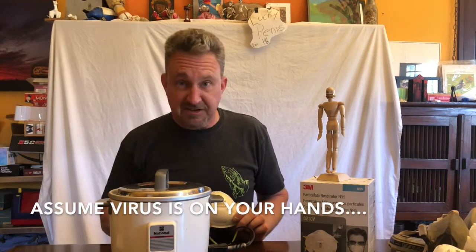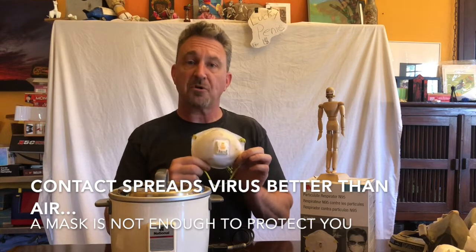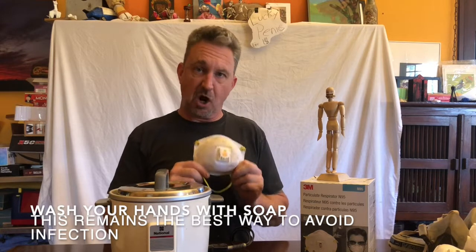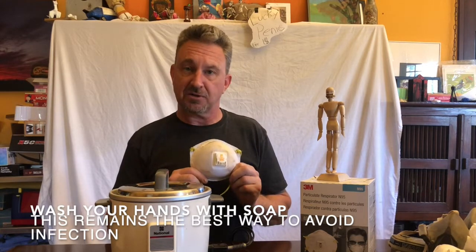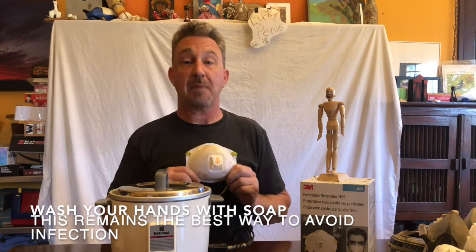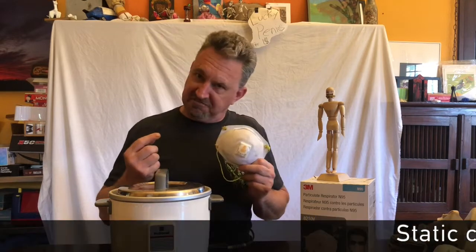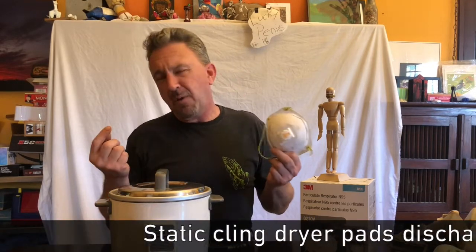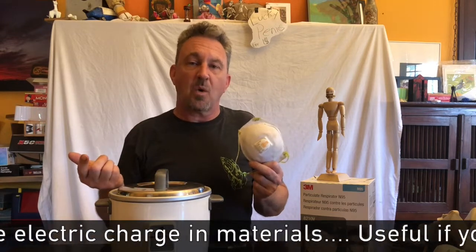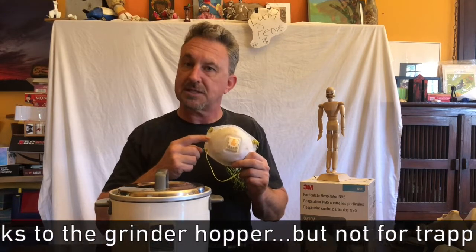Now a little bit of explanation here. This mask is made out of polypropylene plastic. That polypropylene plastic has a negative ionic charge to it which attracts particles — it's the same technology that's used in say a Swiffer pad or a microfiber towel. That negative charge doesn't go away. You can defeat it for a short period of time, but why would you? And most importantly, it doesn't go away.